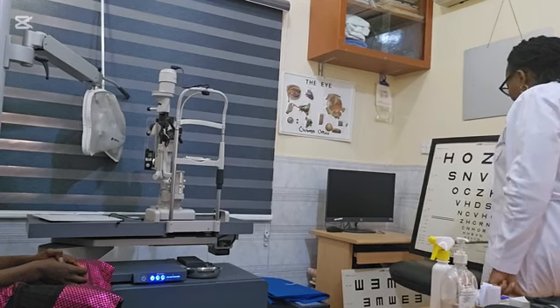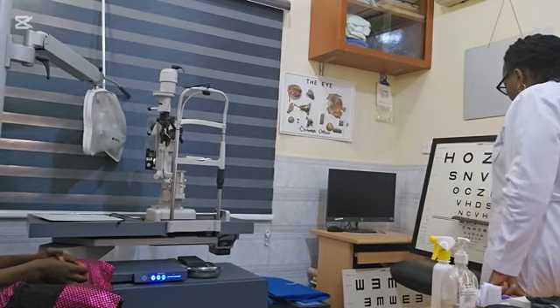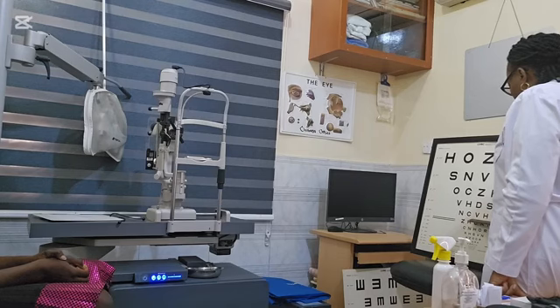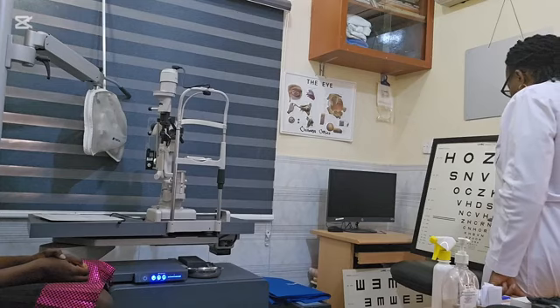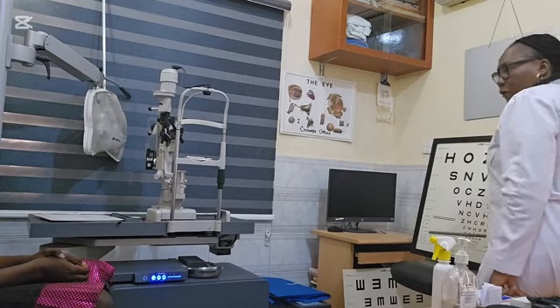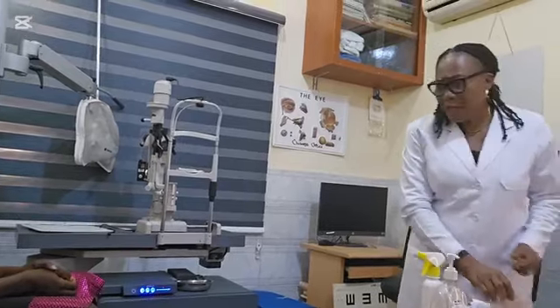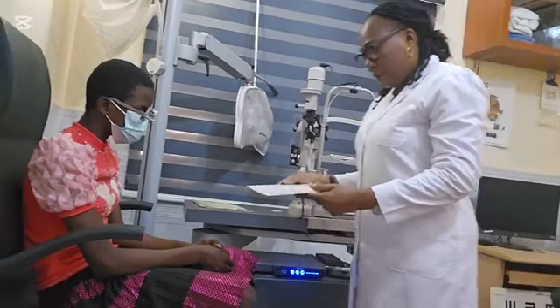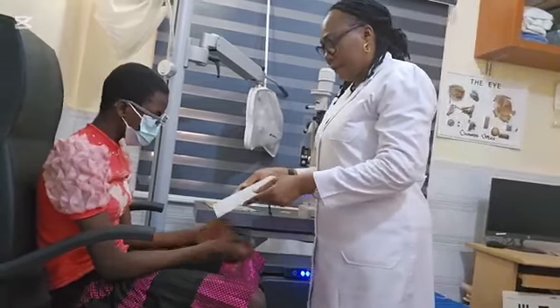So what's the last line you can read now? That one. Go ahead. NCVNO. Beautiful. So let's do the near visual acuity using a Colenbrander mixed contrast card.